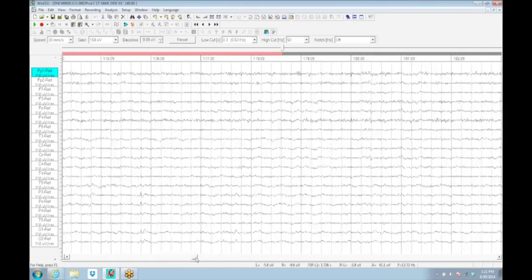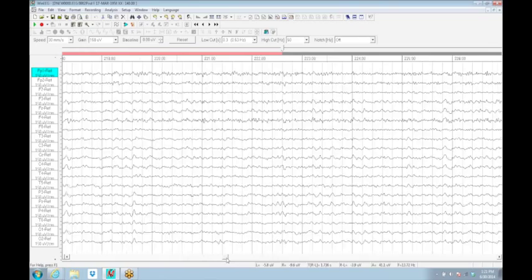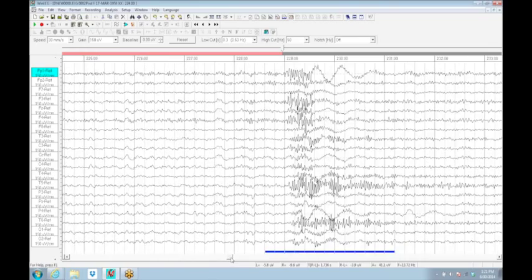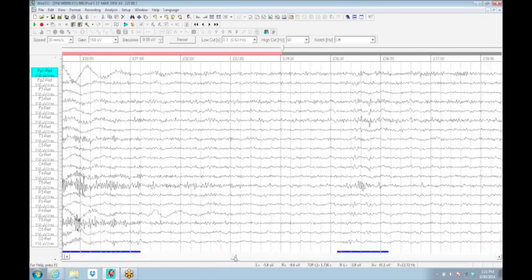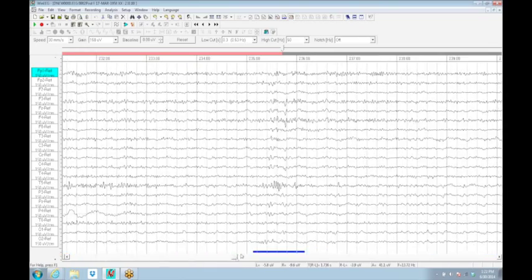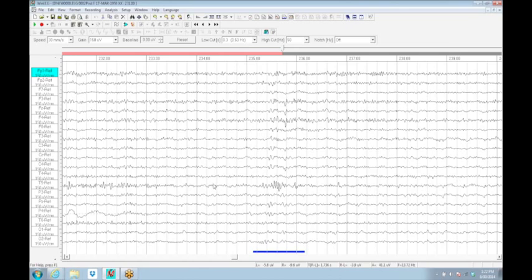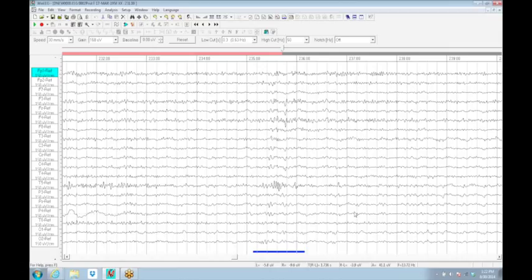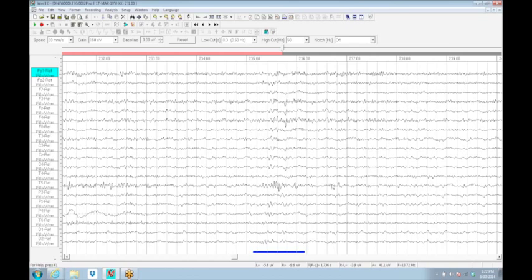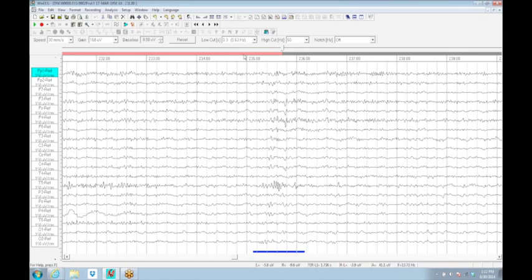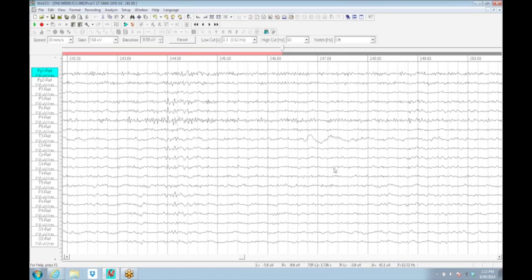There was a bigger piece off to the side that had been selected previously because of the other artifact. The standards for EEG say I need to be able to get back my entire raw EEG again. I can't filter it to get rid of this and not get it back. I have to be able to recover it. Otherwise, I don't meet minimum standards for a clinical EEG. If I click on this ICA component again, all of it comes back. If I change a filter, all of it comes back.